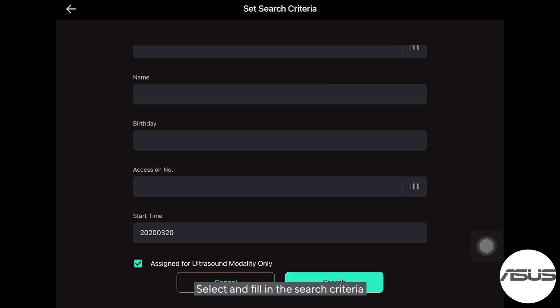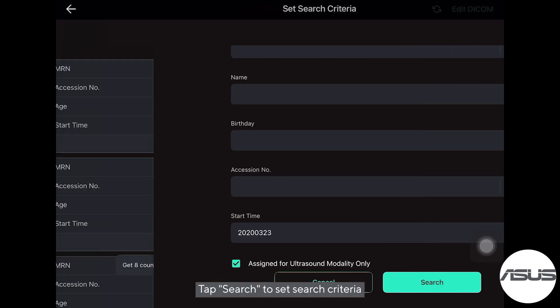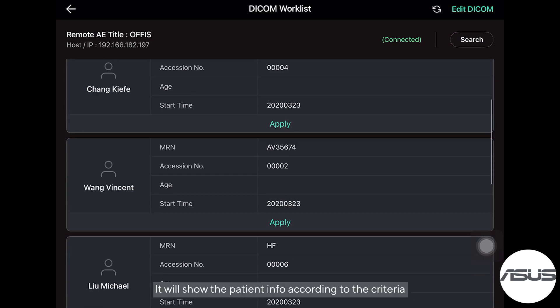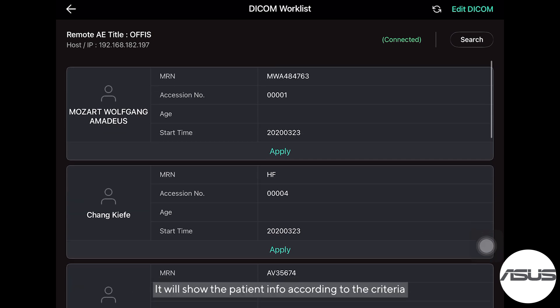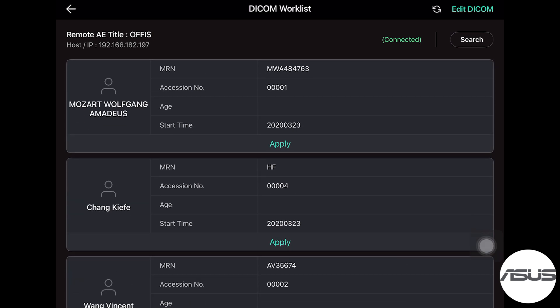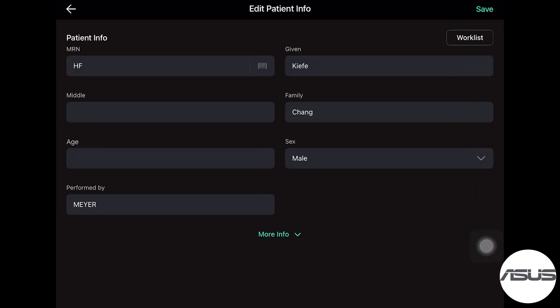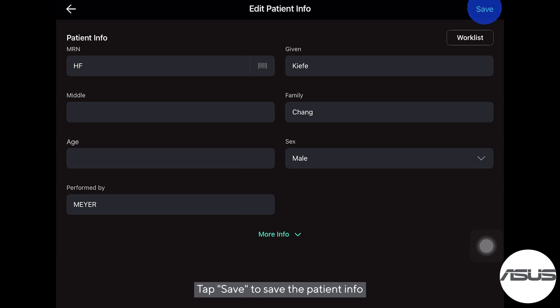Select and fill in the search criteria, then tap Search to set search criteria. Tap the patient that needs to do the exam. Tap Save to save the patient info.